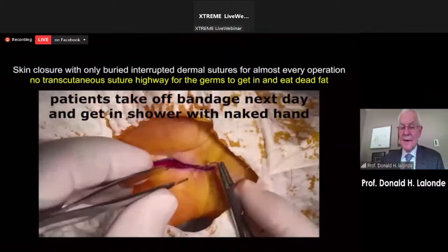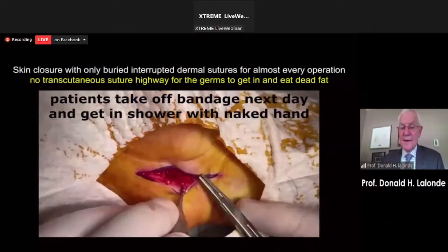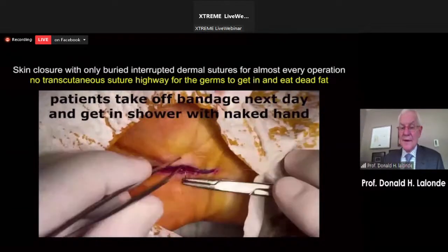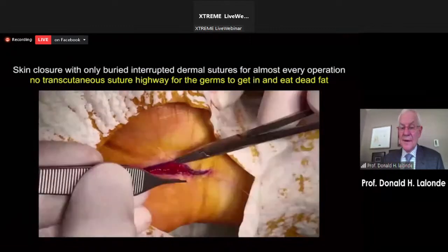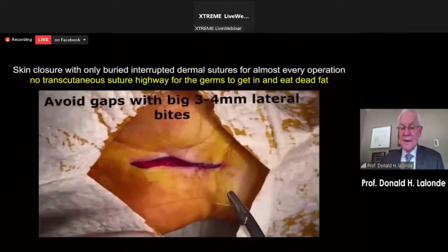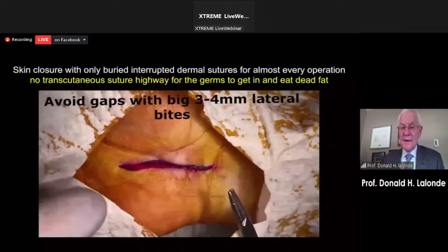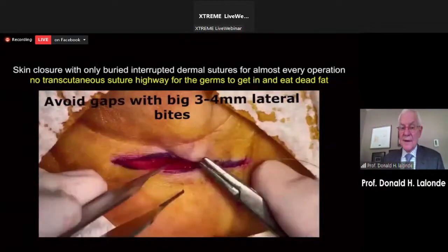Fat has no holding power and just dies. So really evert that dermis. I'm looking on the other side to make sure that I don't buttonhole. And I aim for that flat part of the skin that I can see. They're not really perpendicular to the skin, maybe 45 degrees, but there you see getting a good lateral bite.